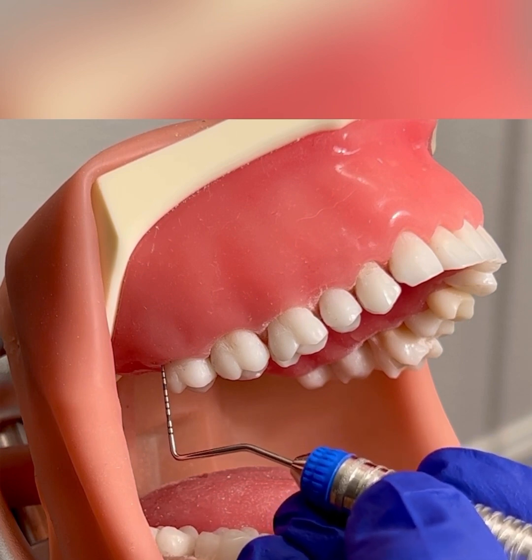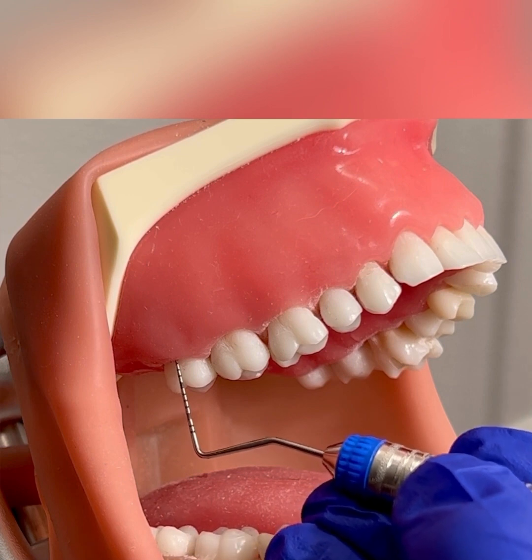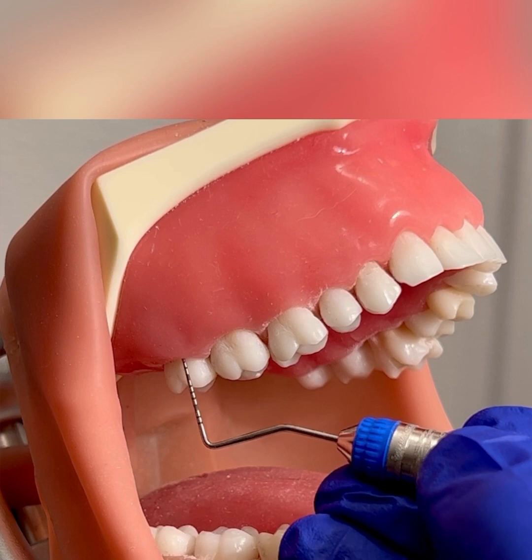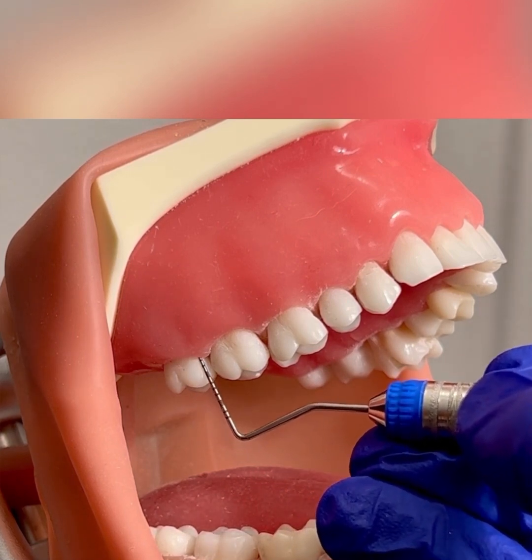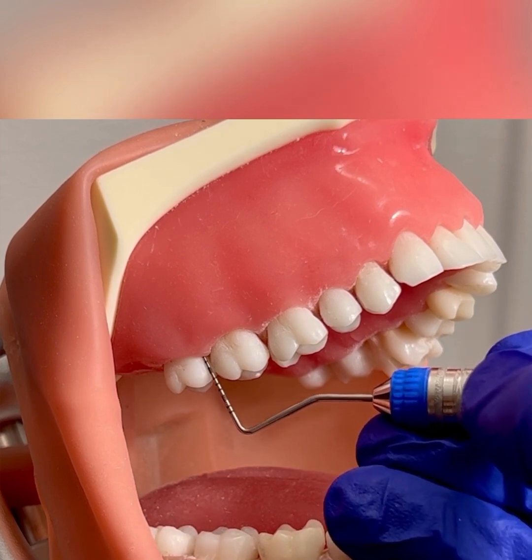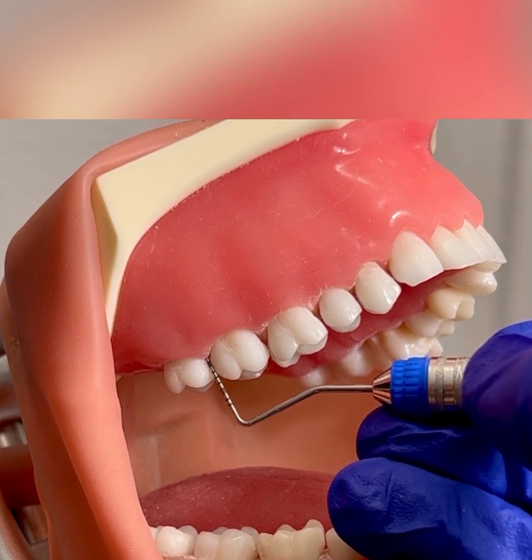I'm going to continue across the buccal surface using a walking step, keeping the probe nice and parallel to the tooth surface. I'm also in contact with the tooth, walking across the buccal. The deepest reading across the buccal will be the second reading, and I'm going to walk into the mesial and proximal to get my third reading.